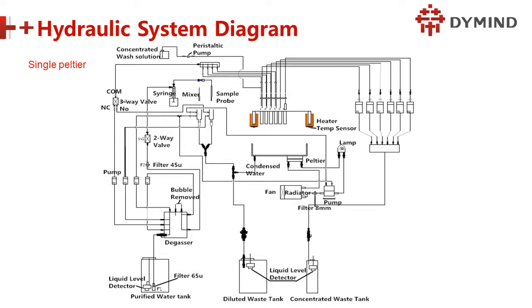Okay, just a moment. We are seeing the drainage of the two wells here. Look at here. This is the drainage system. At the bottom of both wells there is a drainage, and the drainage goes into this tank. You can see here is always on. Always open. So if I put some water in the well, it will automatically go to this tank, even if I have a pump pumping water in here. Maybe the pressure is very high, right? The inlet is high, but don't worry, we have an automatic overflow, and it goes out.